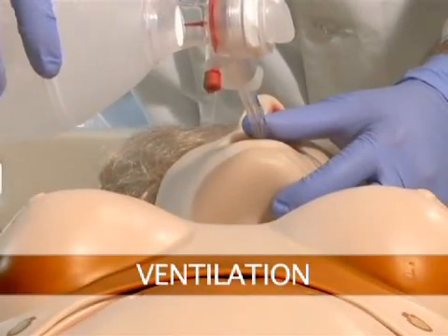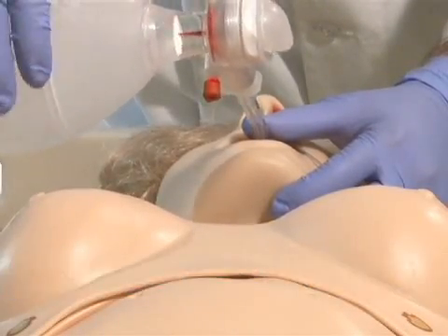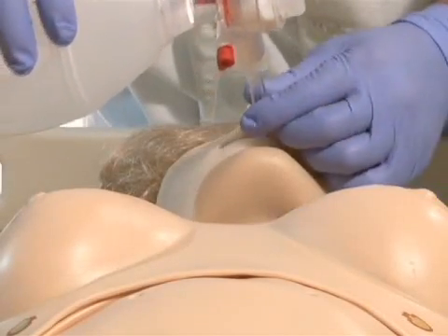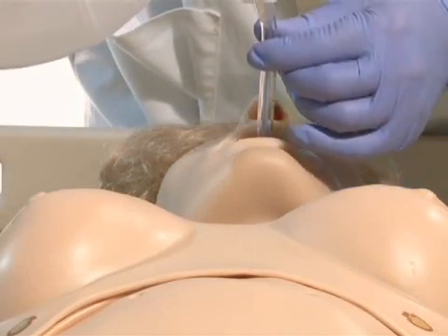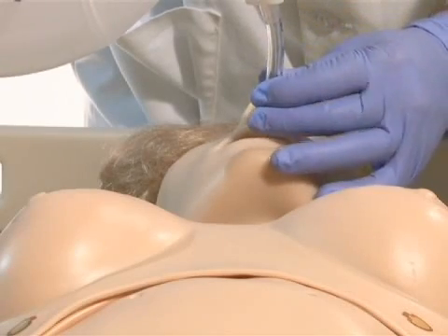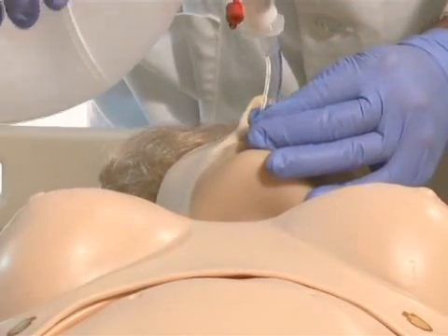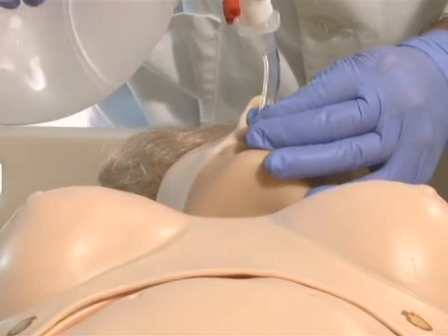Suzy can be ventilated with a BVM or a mechanical ventilator. Once intubated, sensors detect the depth of the intubating tube. Should the tube be inserted too deep, the left lung is automatically disabled, realistically demonstrating right main stem intubation.